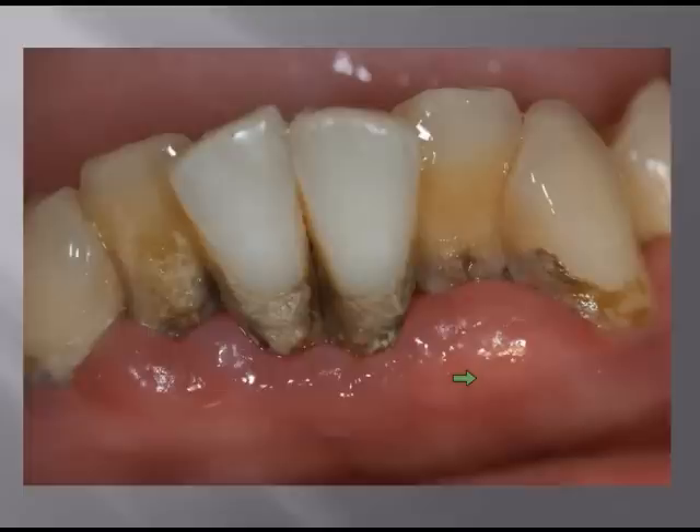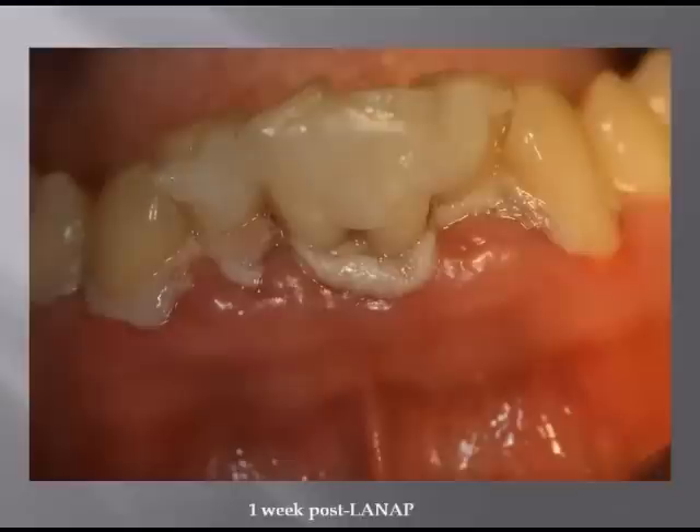I gave no guarantees on his teeth. If we keep them, great. If we lose them, we're no further behind than we were at the beginning. We went ahead, we did full LANAP on him, and in a couple of slides you're going to see his maxillary teeth at the same time.